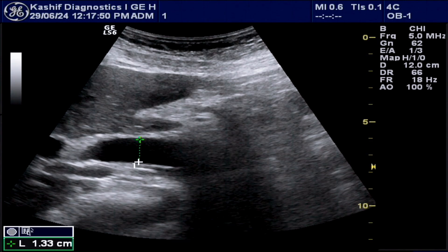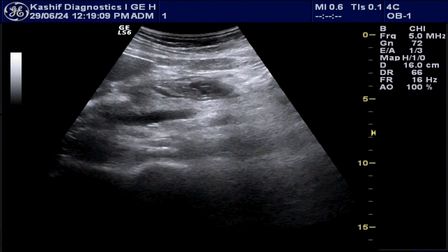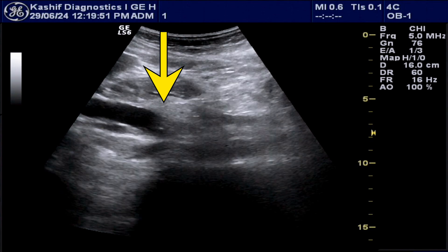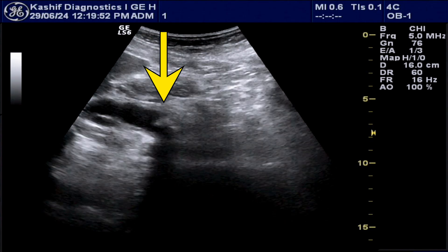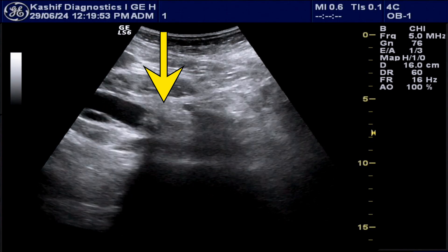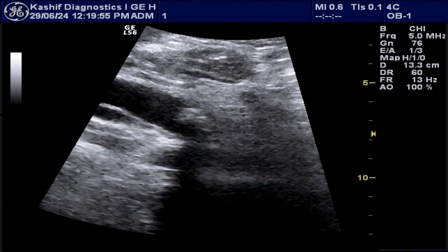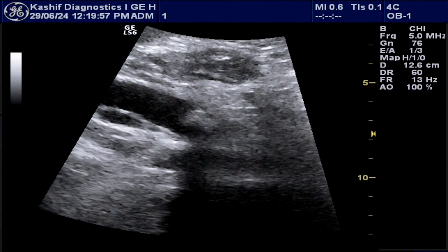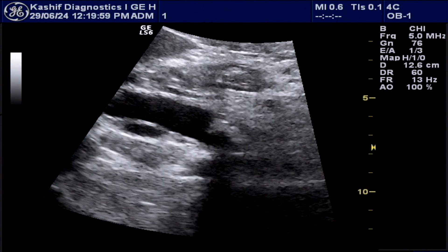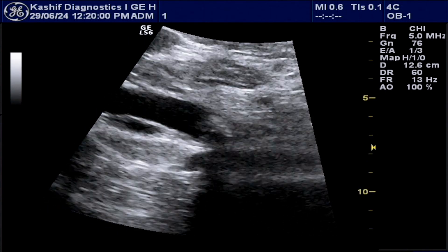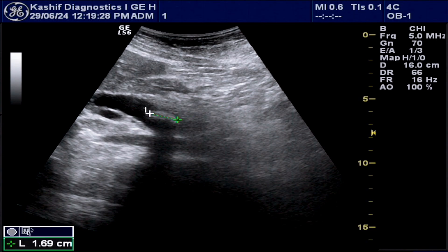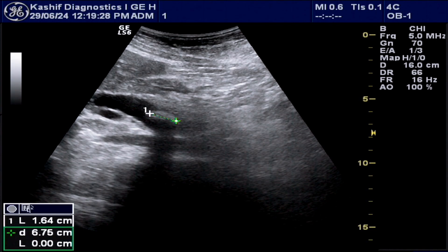There is a large calculus seen in the distal CBD. This view is taken from lateral decubitus position and in supine position. This is a very large stone — its size is 16.4 millimeters in length and the AP width is 6.1 millimeters.